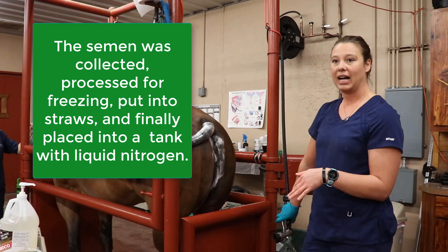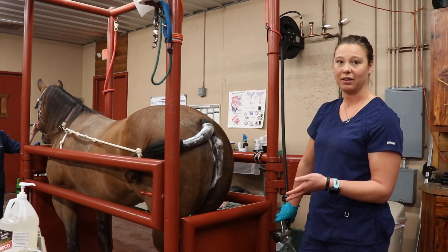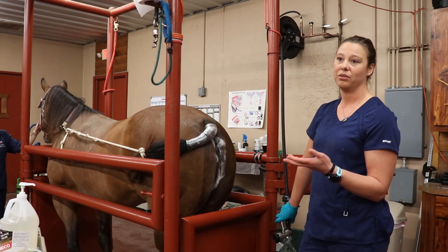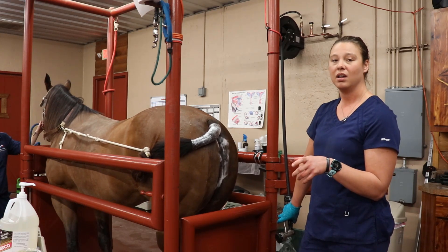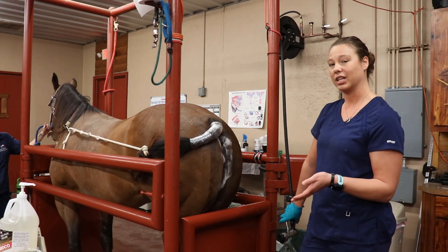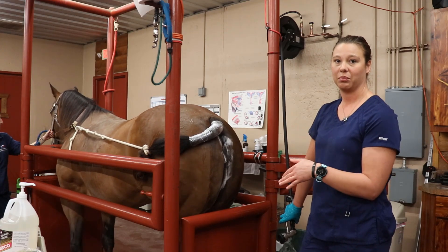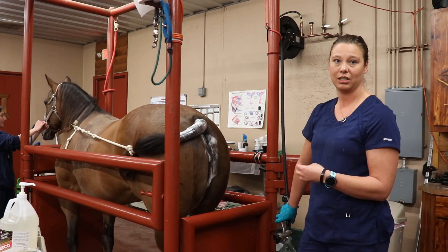I'm going to breed her tonight to cover her just in case she were to ovulate overnight, so that we have semen in there within that 12-hour window before ovulation. Then tomorrow I'll check her first thing in the morning, follow her midday again, and do a second breeding immediately post-ovulation.